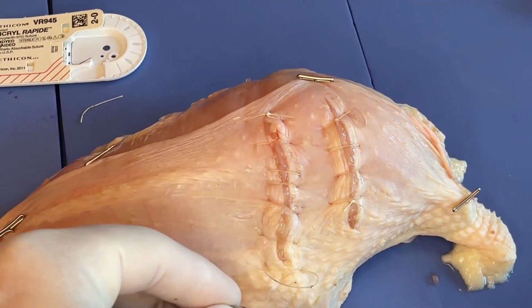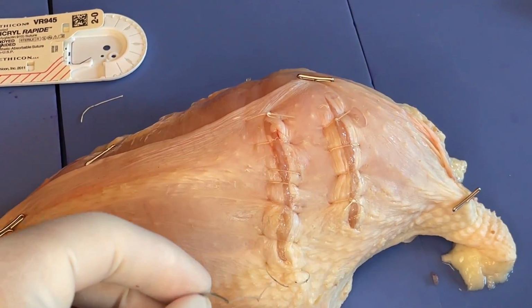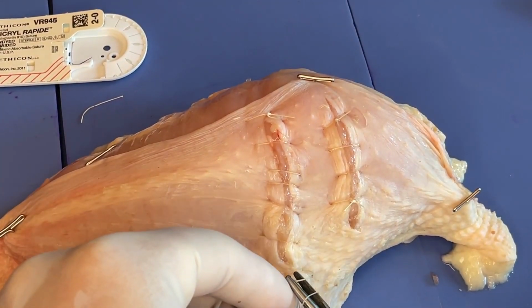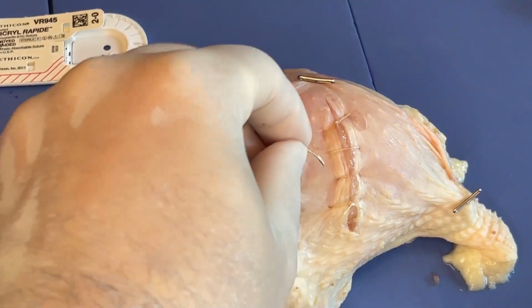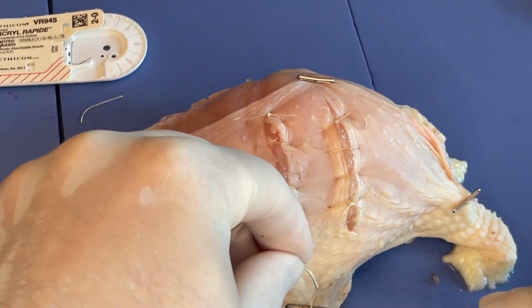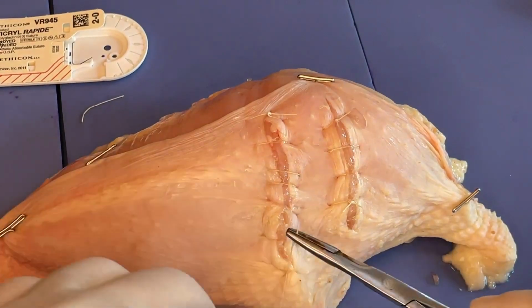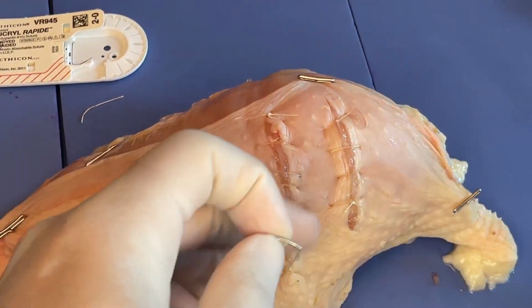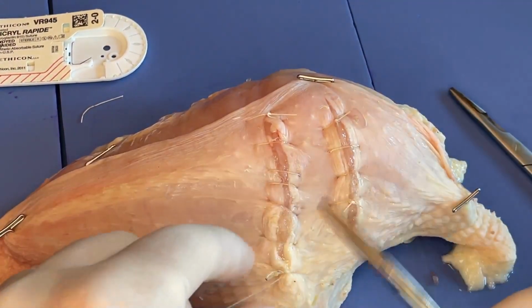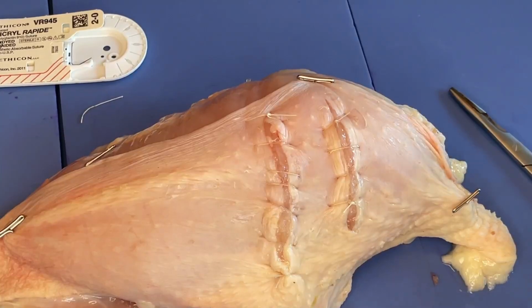I'm going to do a little wrap, grab that loop with my very cheap needle driver and pull it through. And again, loop around the tip of the needle driver, grab my free end, pull it through. There you go. That's just 2 throws, which normally we do 4 for Vicryl. And then we'll cut that.